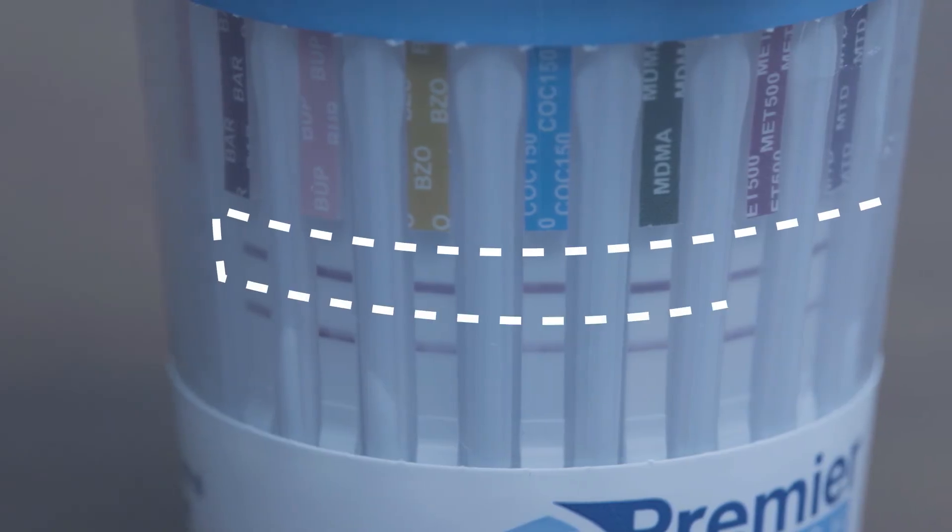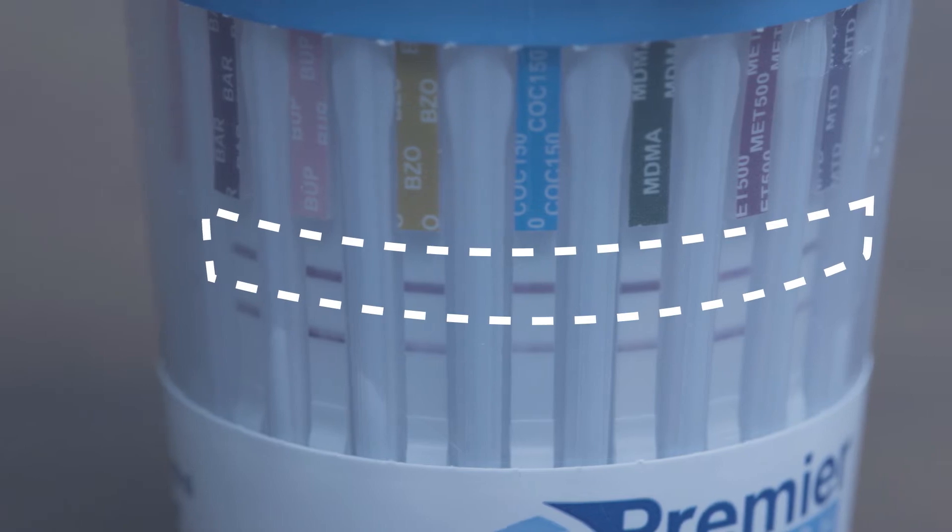Make sure that the top control line is visible for all test strips, otherwise the test is invalid and the results must not be used. Two lines appearing as seen in this example show a negative result. Negative results can be read as soon as the top control and bottom test lines are visible.